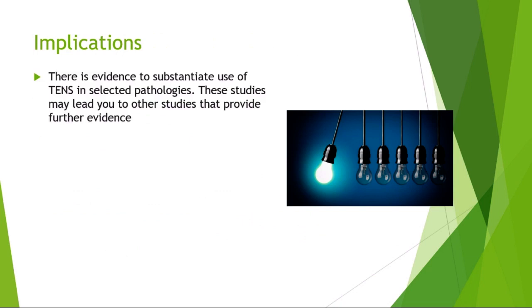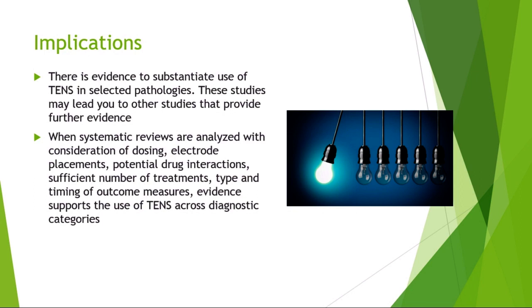The implications are that there is evidence to substantiate the use of TENS and other electrical stim applications in selective pathologies. So the studies that are out there now might lead you to other studies that provide further evidence of the efficacy of this treatment with certain diagnostic categories. When systematic reviews are analyzed with the consideration of dosing, electrode placement, potential drug interactions, sufficient number of treatments, type and timing of outcome measures, overall, evidence supports the use of TENS across several diagnostic categories.